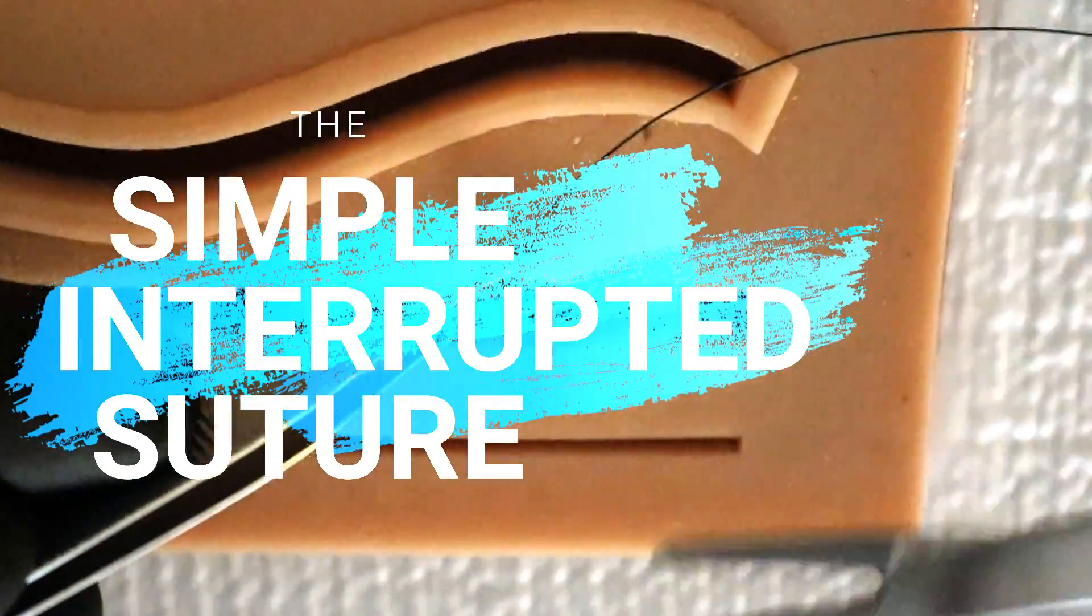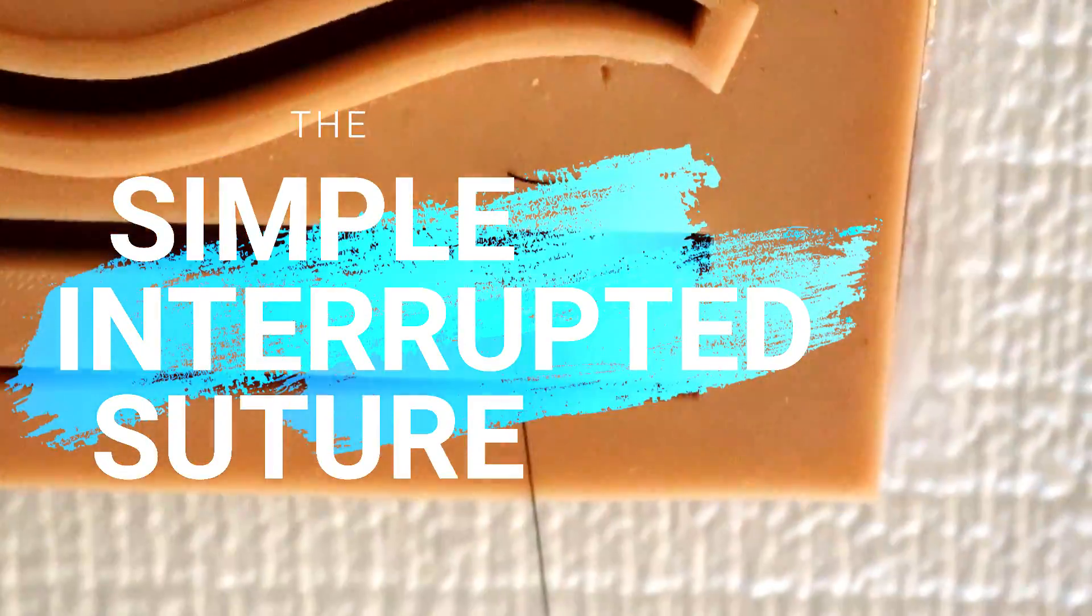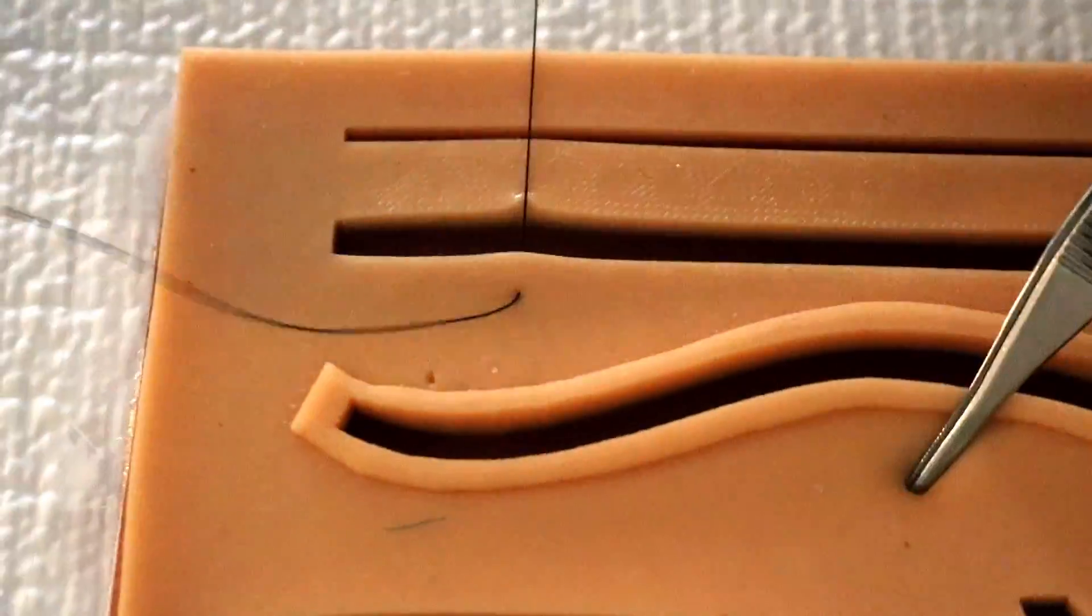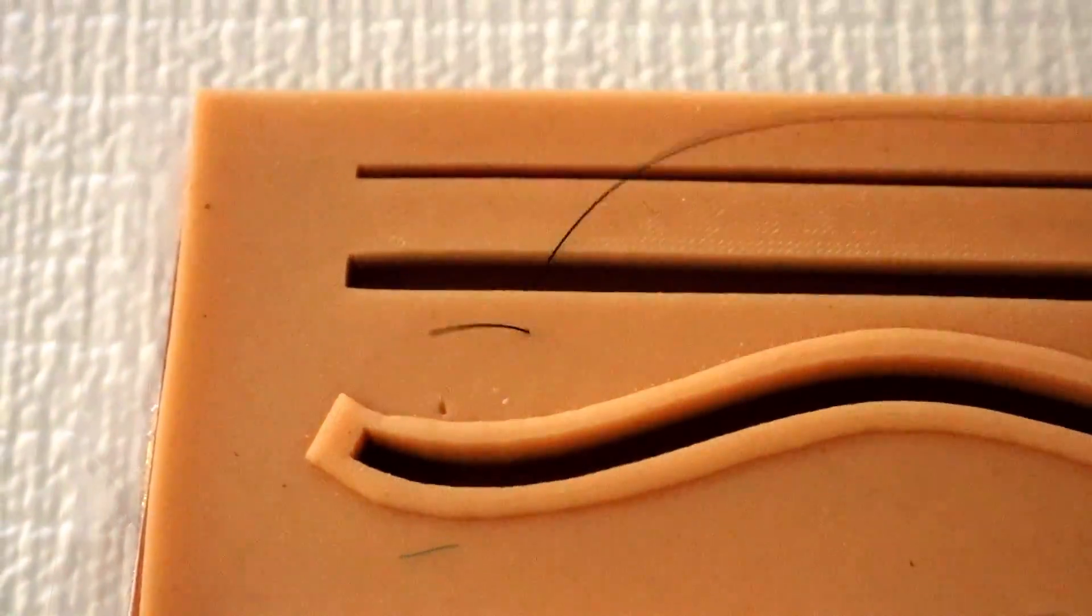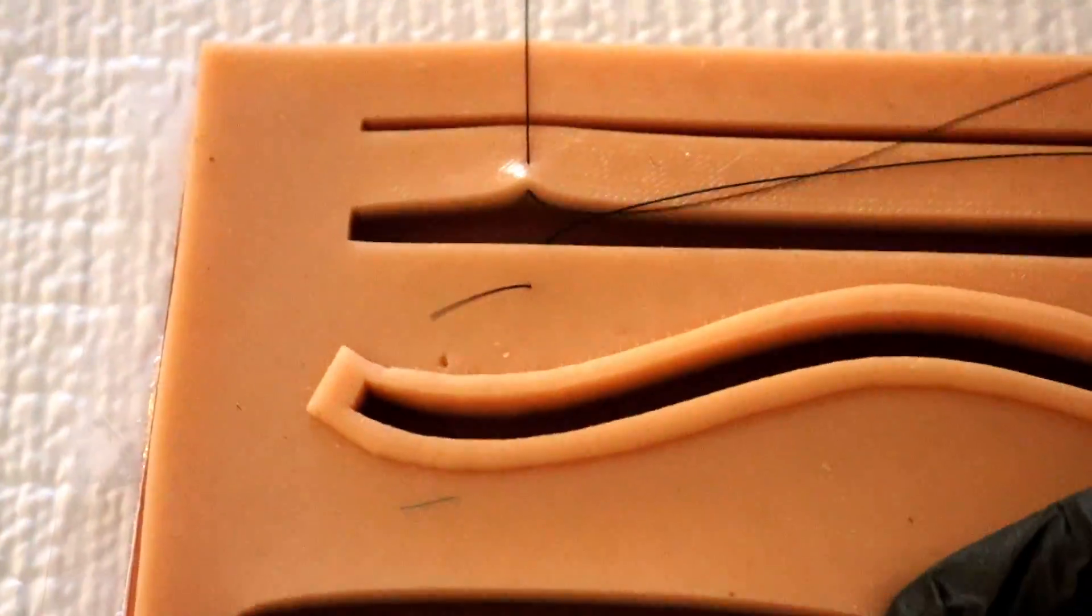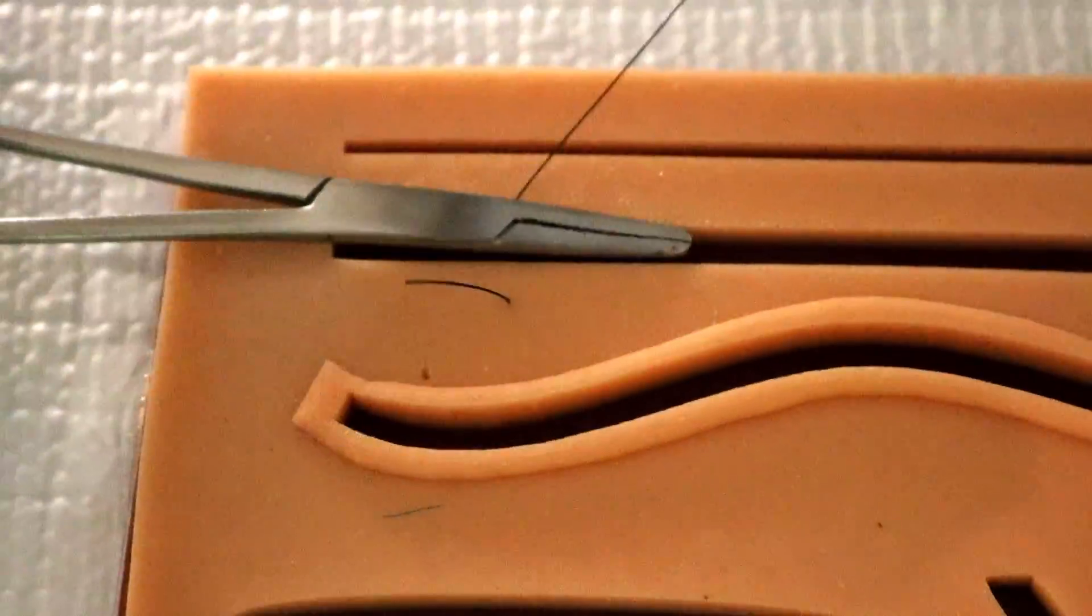Hey everybody it's Dr. Rahimi here and today we're going to talk about a simple interrupted suture. We're going to go in depth with this video and talk about how we load the needle, how we do our wrist supination and how we do our instrument ties and everything else.